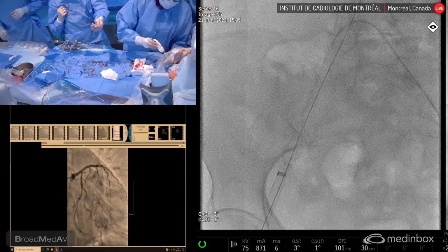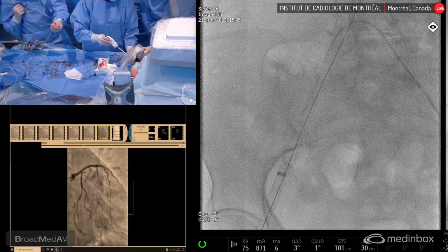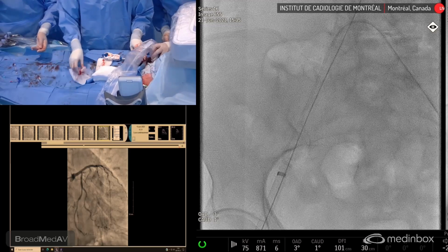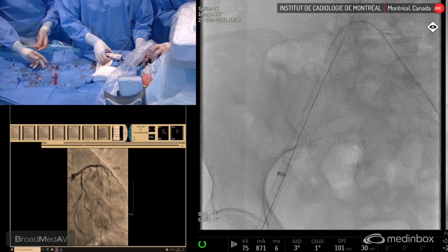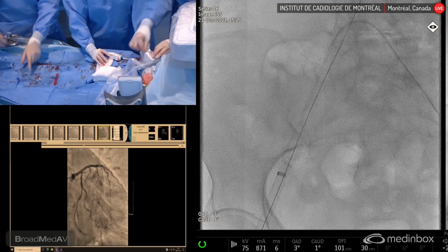All right. 45 degrees. Pulling out. Green, blue. Green, yellow. No. Collagen is down. Yeah. Okay. Let's see in cross section if we see the results. We can show. Yeah. So you can see the collagen plug. The imaging's a little bit more challenging here, but we're going to take an angio now. So Ahmad's going to inject for us.